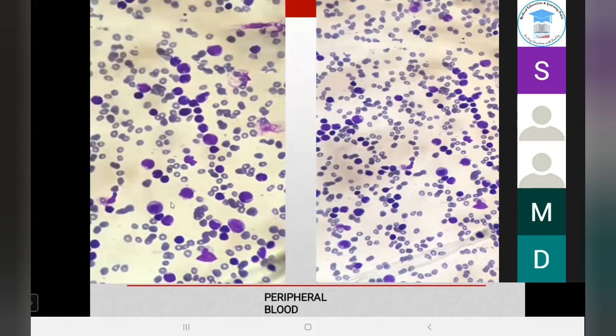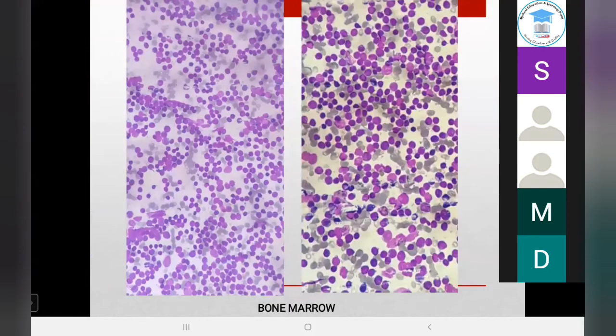Now, when we did a marrow, we saw that there are these small lymphoid cells which were very classically CLL, but there were certain cells which were also larger in size. Can you appreciate these cells which are a little larger in size? It's not a very beautiful picture, but still you can see some cells which are larger in size. Okay. Yes, ma'am. So obviously, when we saw these larger cells, we thought that maybe it's actually like a PLL transformation which is going on. But since you have a flow cytometer, you are always tempted to put it up. So this is another picture which shows. Now here clearly you can see that there are these small lymphocytes and these are large blastoid-like cells which are like the prolymphocytes. So we put up a flow.